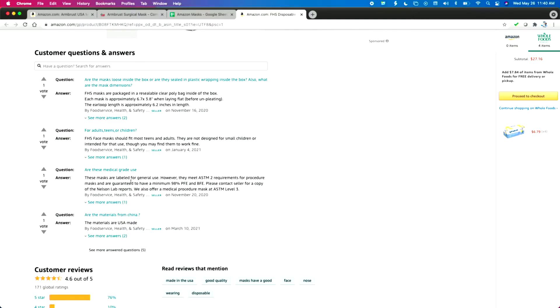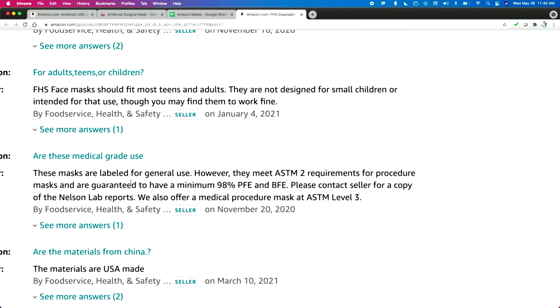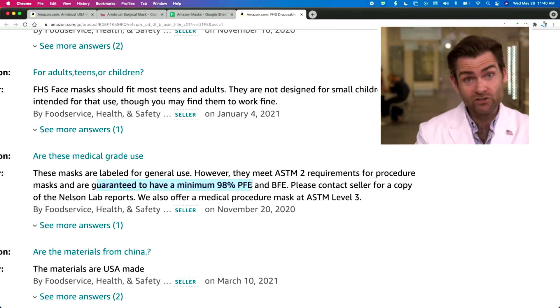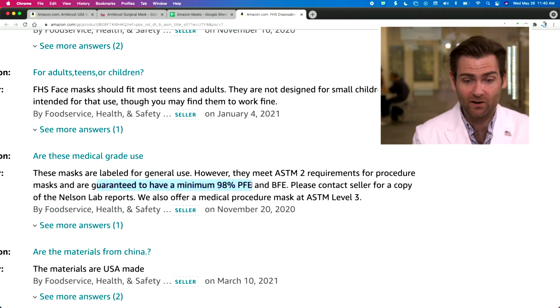If I look at the listing here, they're saying these masks are labeled for general use. However, they meet ASTM-2 for procedure masks and are guaranteed to have a minimum 98% PFE. They also offer medical procedure masks at level three. Guaranteed. Well, we shall see, because it turns out that's what this machine is made to test. We will see if they are hitting their 98% guarantee.